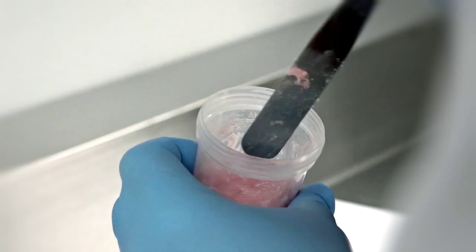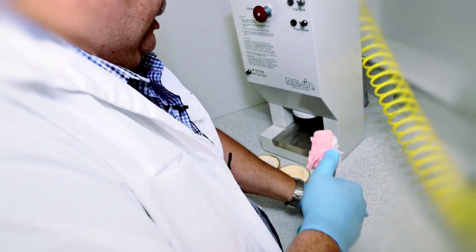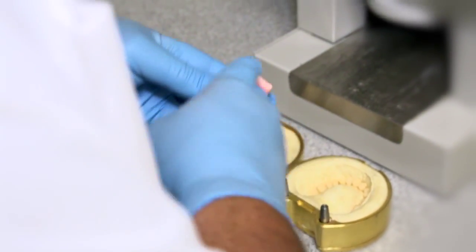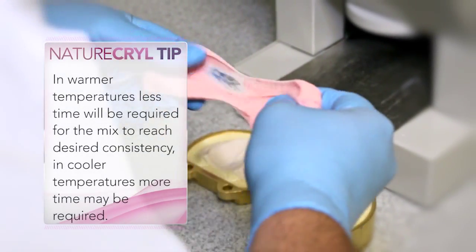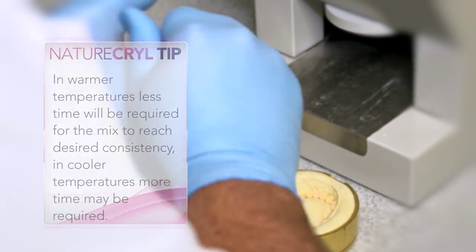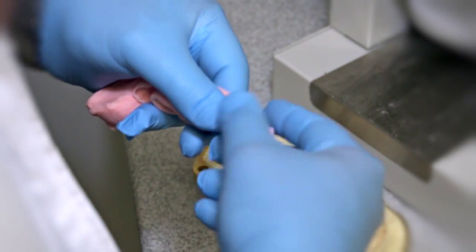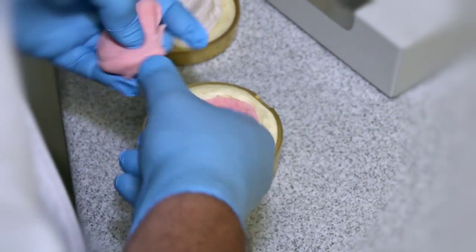And then we're going to put a top on this and let it set for about 5 minutes. Take the acrylic out of the container, knead it a little bit, pull it over itself. And we don't have to worry about getting this to a snap set. You can pack it before that, which is a good thing if you have a lot of cases. Flatten it out, get the veins going in one direction, pack it around the borders, and the facial. All the veins will be going up one way.